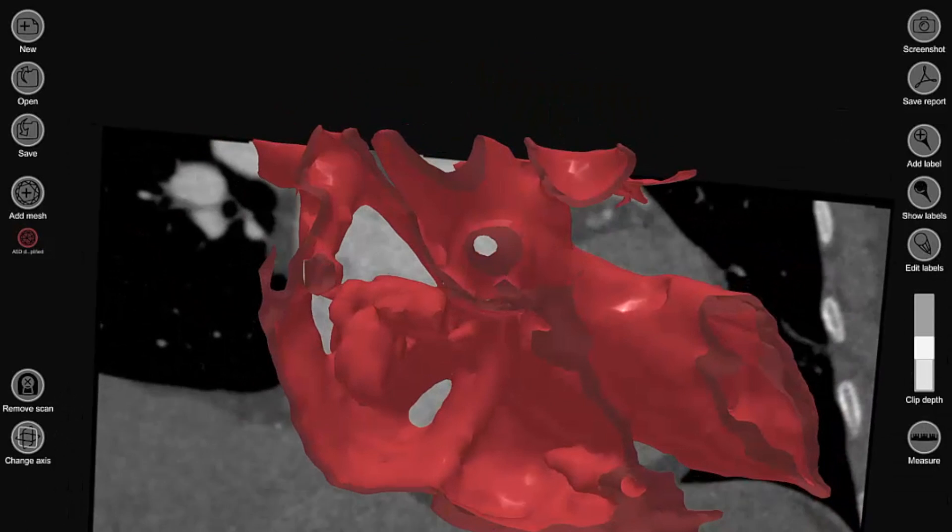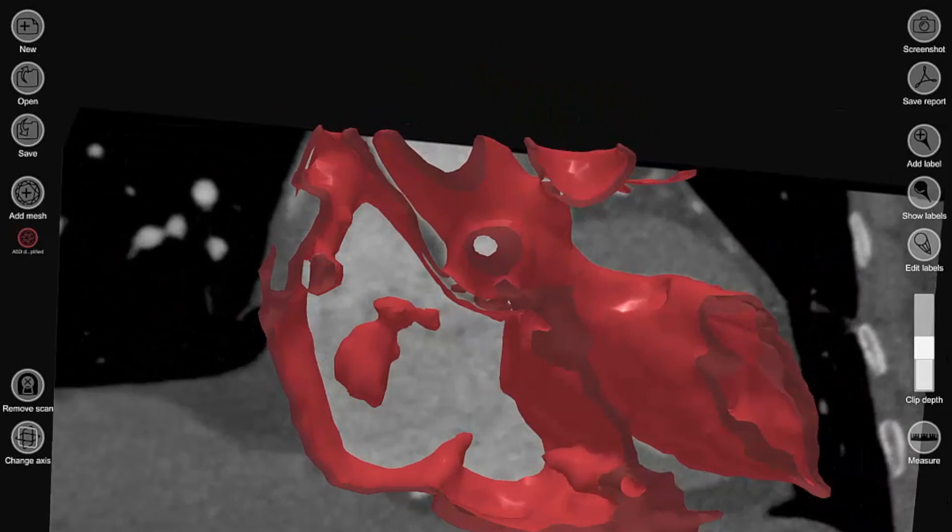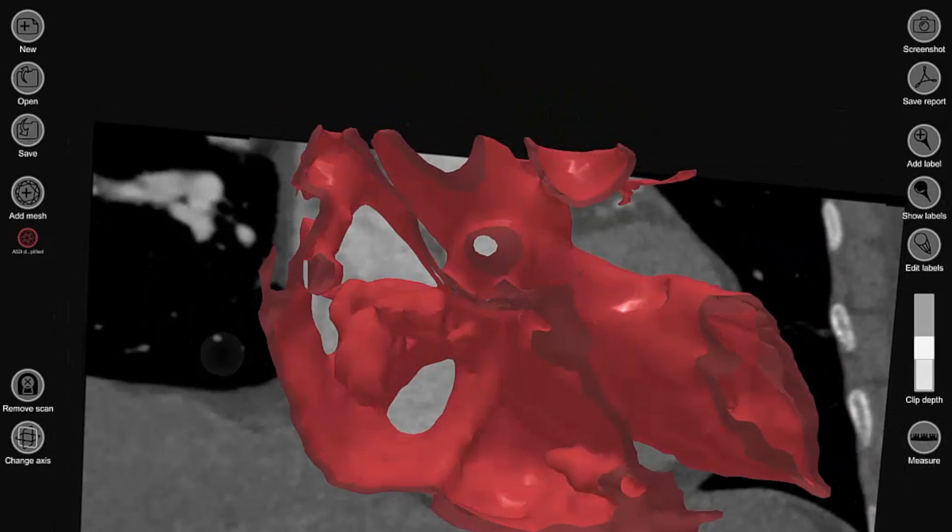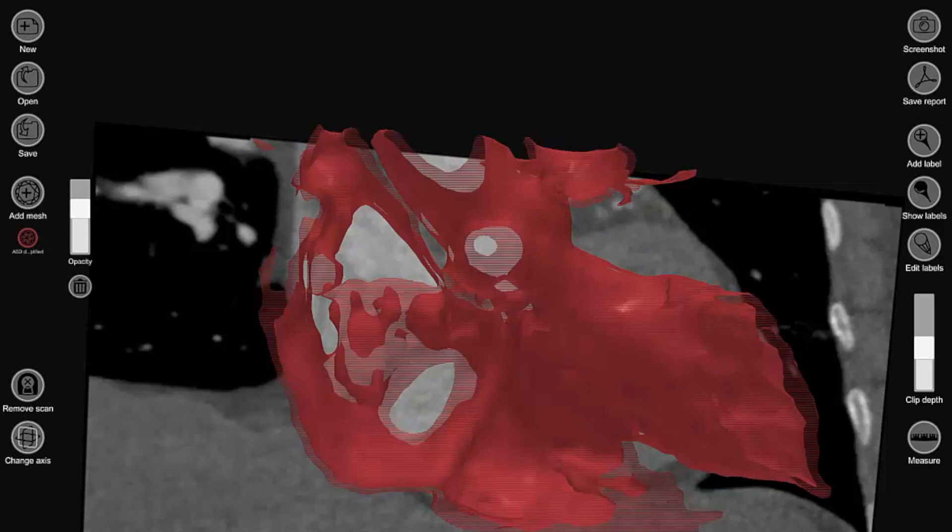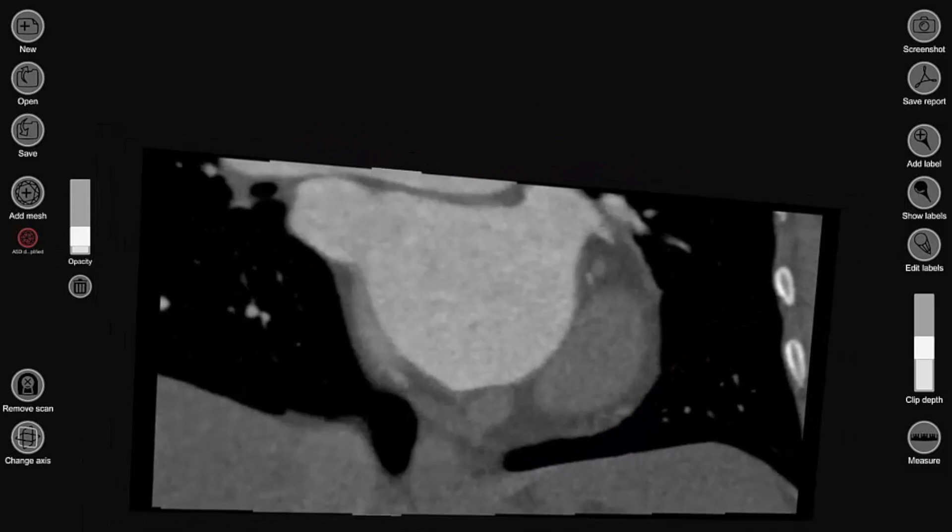We have options where we can display the medical images, we can display the 3D model, we can display them both at the same time with varying degrees of transparency.